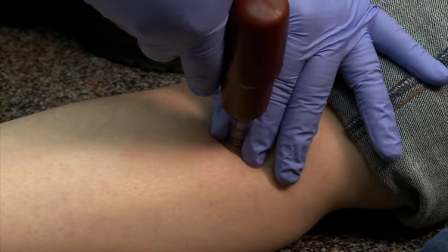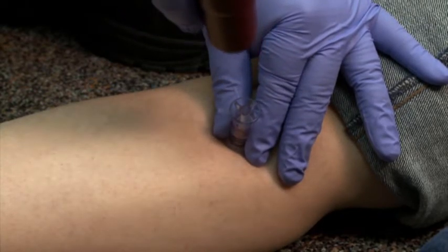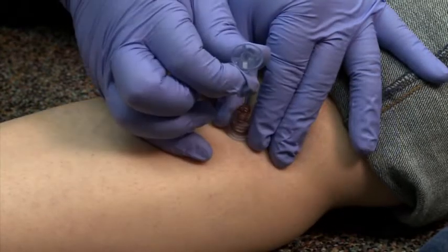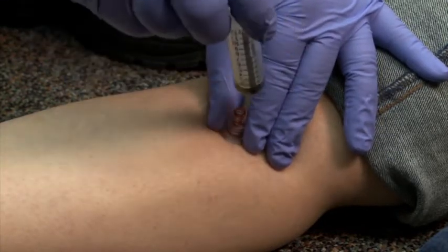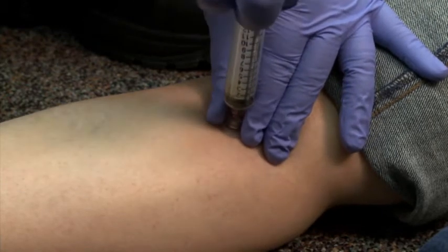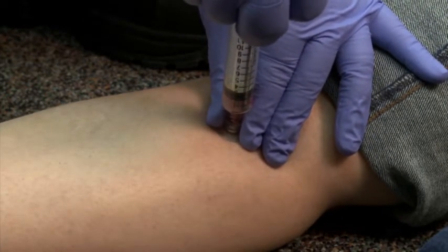While holding the needle in place, remove the drill from the I-O needle. Next, release and remove the trocar from the center of the needle. Attach the syringe with saline to the needle hub and draw back the syringe plunger slightly, looking for fluid from the marrow cavity to mix with the saline.